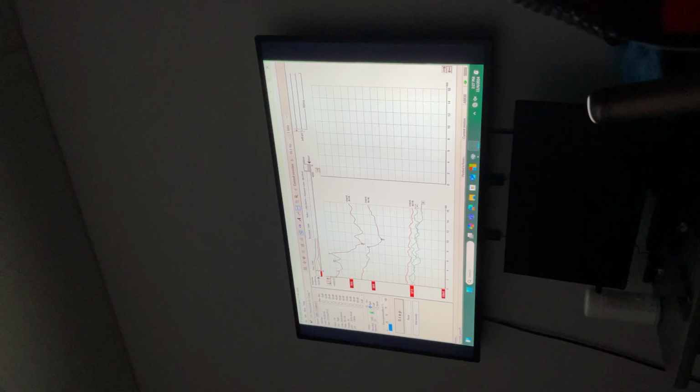At 30 there was a really big response, so I went down to 10. What do you think 10 is? There is a response. This is too far. Probably this one. What do you think, class? I agree. Could be one, but look at it. It's negative, it's going down. We'll average more. Oh, okay, no bias. Be open-minded.